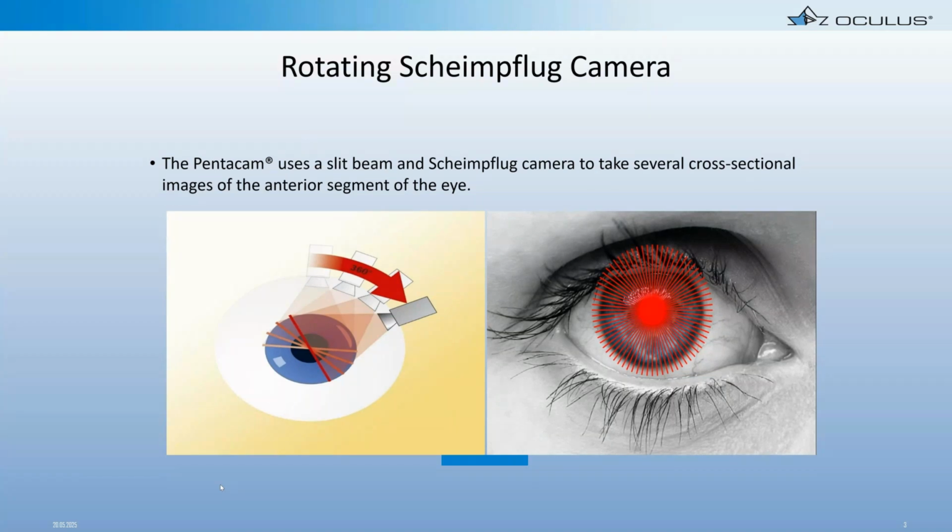But maybe 5, 6 years ago, I was talking with Bill Tulo from Oculus, and Bill encouraged me to try using the Pentacam as well. So we started doing Pentacam and keratograph on every patient we did Ortho-K on, both pre-treatment and afterwards as well. We just ran them both to see how it went. As we transitioned to using our Pentacam for our baseline imaging for lens design, our first fit success was significantly improved.